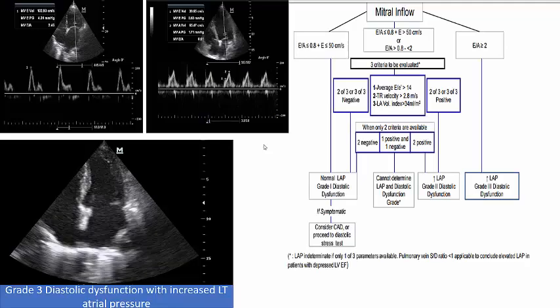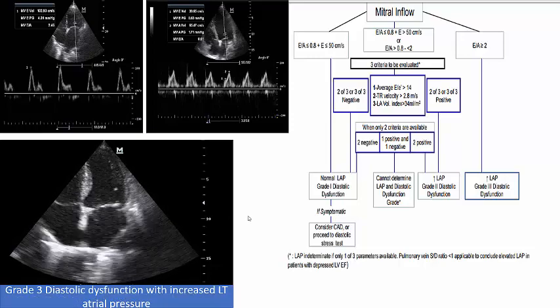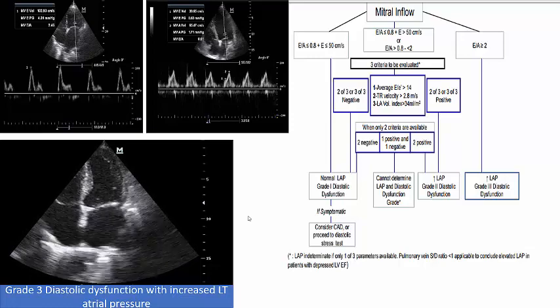What about the left side? On the left side, our patient has straightforward ischemic heart disease, wall motion abnormality, a dilated left ventricle, and very poor ejection fraction. That means our patient has cardiac disease, left side heart disease. To apply the hemodynamics regarding left side pressure measurement and pulmonary congestion, it's very easy.